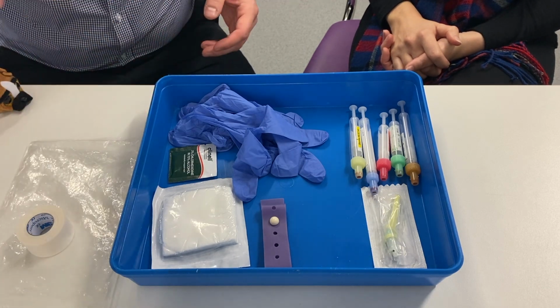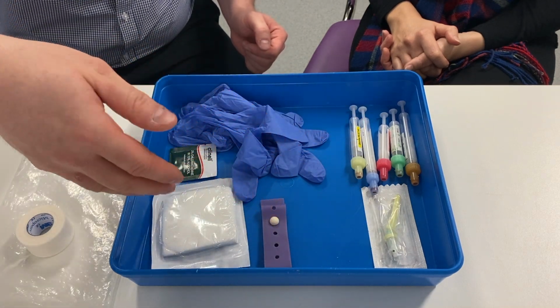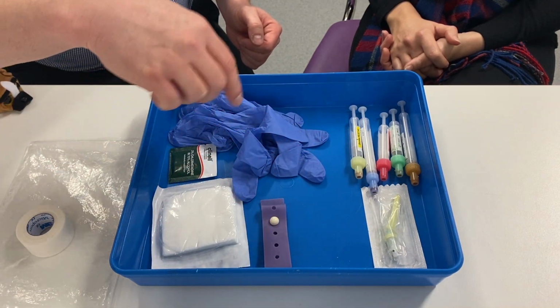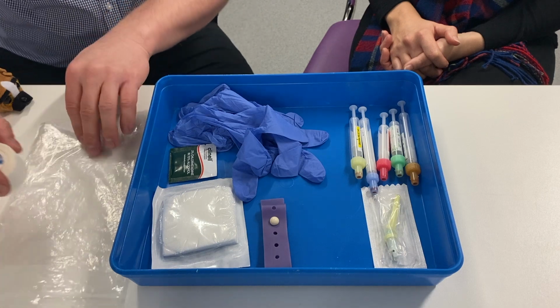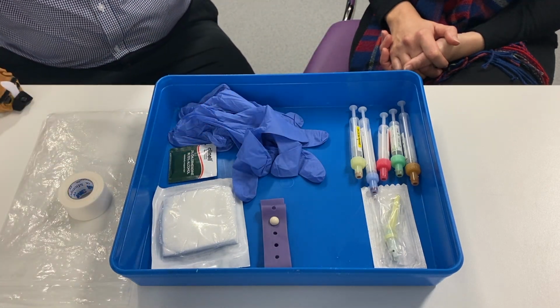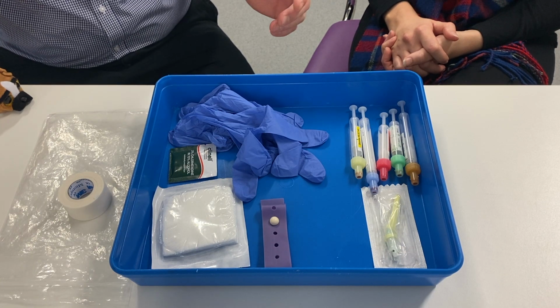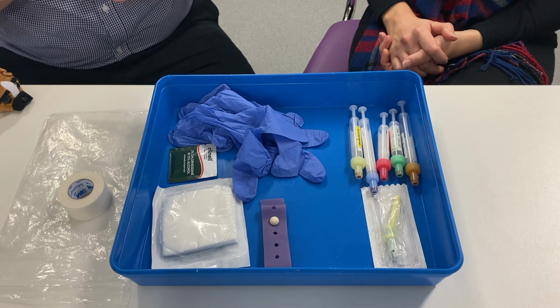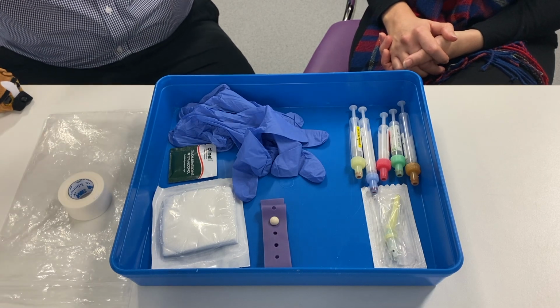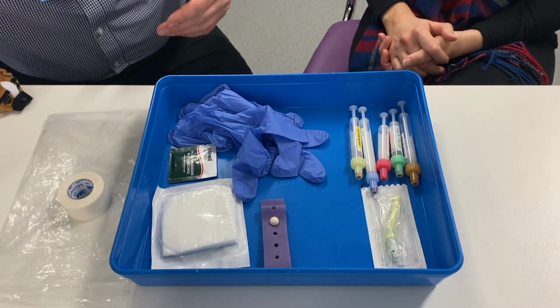And as you can see in our tray, we've got most of the equipment we need. We've got our bottles, our needle, our tourniquet, our gauze, our alcohol wipe and our gloves. We've also got our specimen bag and a roll of tape to stick the gauze on with. We definitely need to make sure we have our form to identify our patient, and then we'd also need a sharps bin with us.